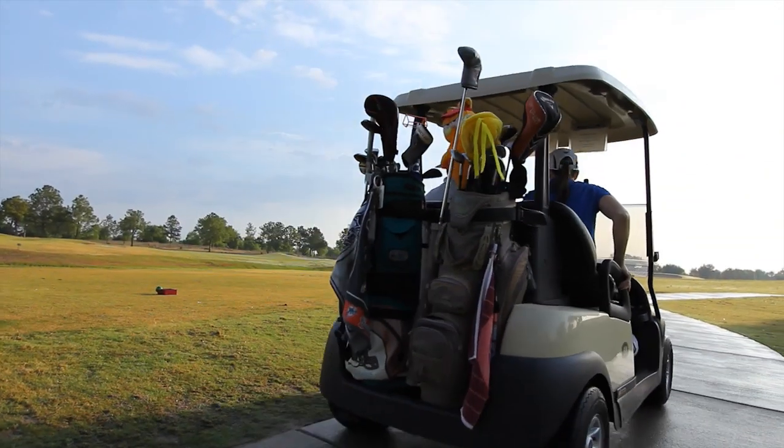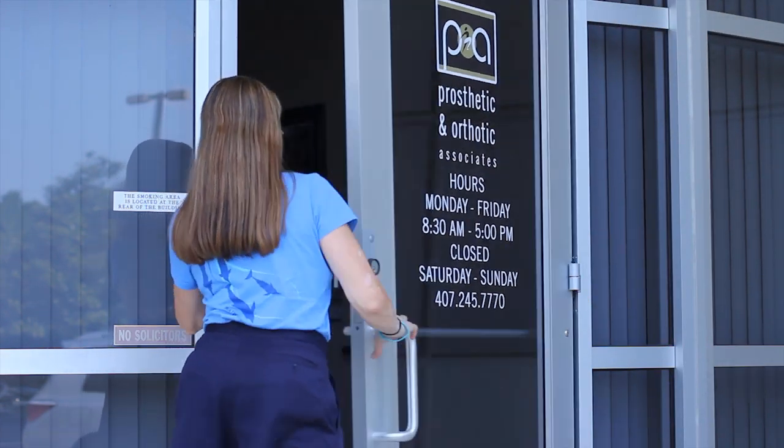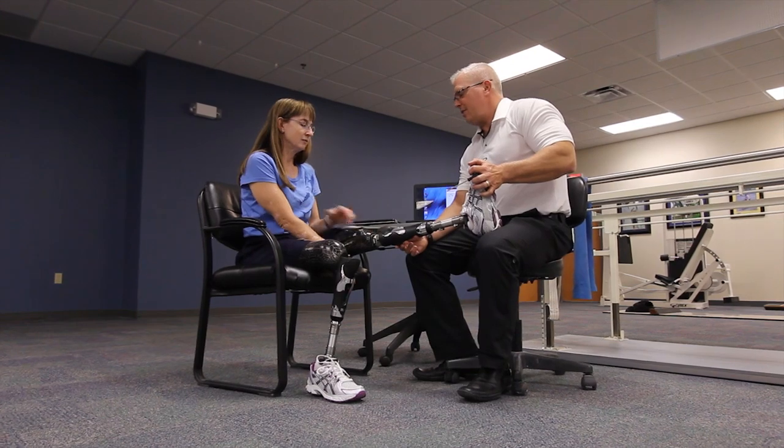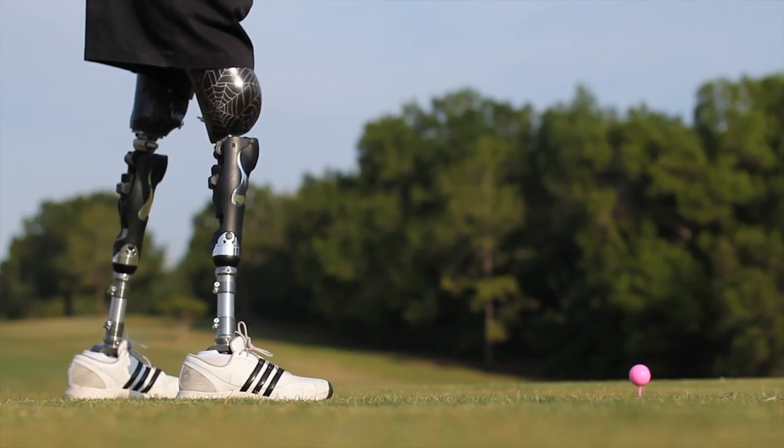I've worn every type of knee, every type of foot that's been out there in the market. I've been working with Zahava for approximately five years now — we call her Zee for short. She's one of the premier amputees being a bilateral AK, in how she gets around and the activities that she does.